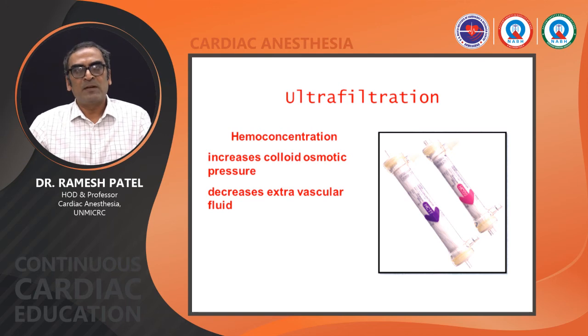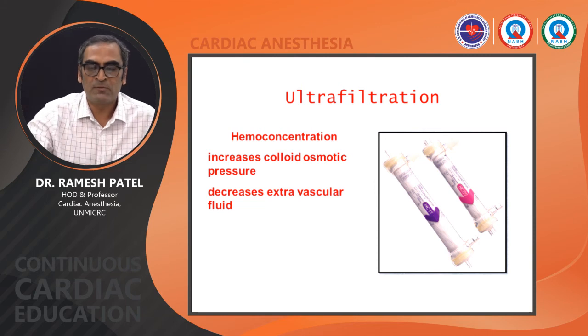Ultrafiltration is another important act that we have to do sometimes while managing cardiopulmonary bypass. This ultrafiltration will remove excess water as well as some inflammatory mediators. In other words, it will help in maintenance of hemoconcentration. It will increase colloid osmotic pressure, and it will decrease extravascular fluid.